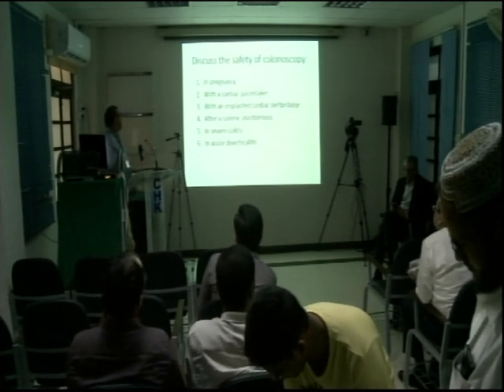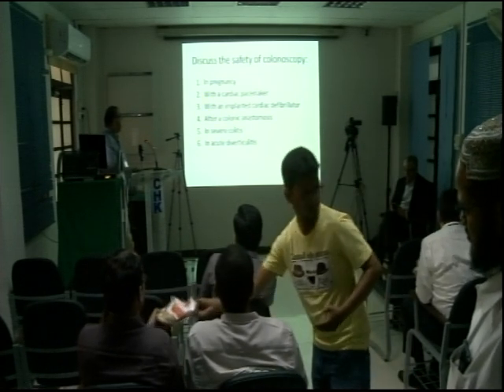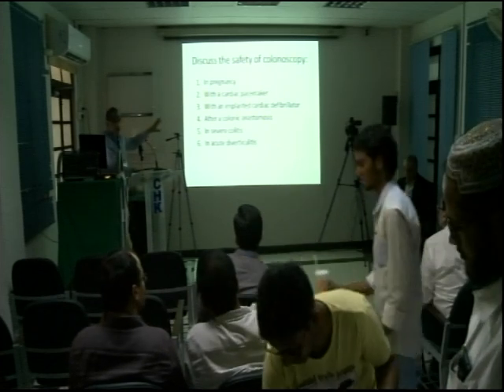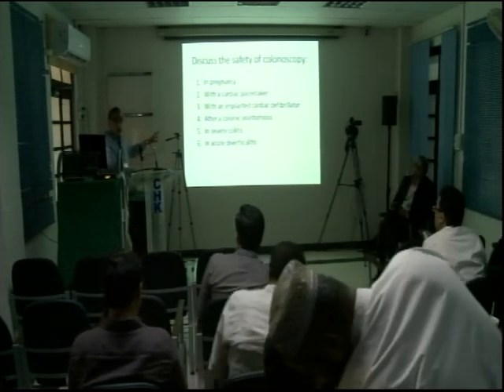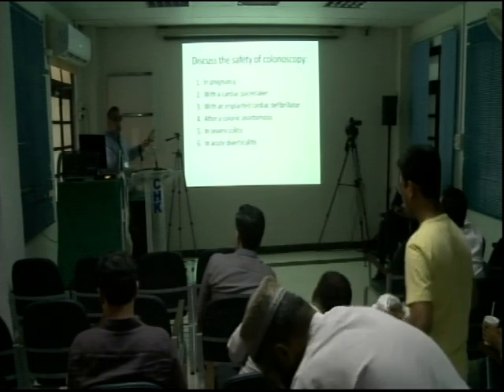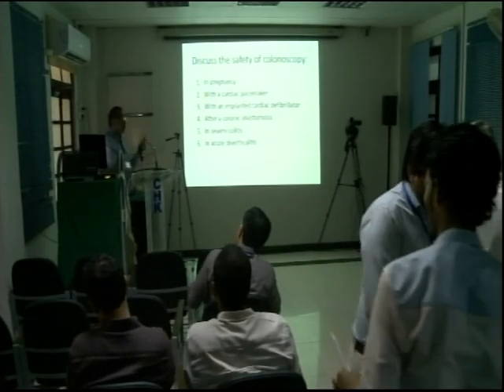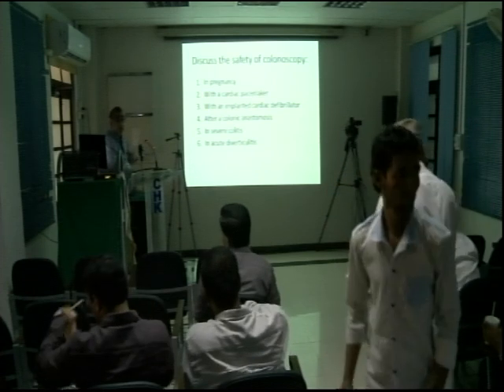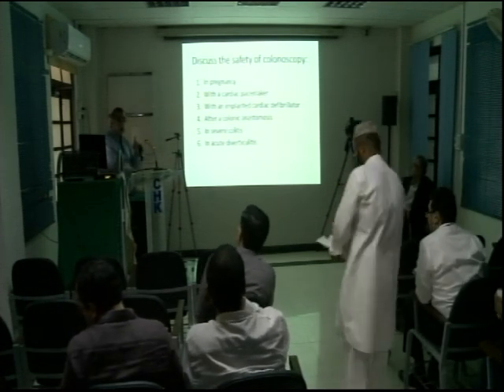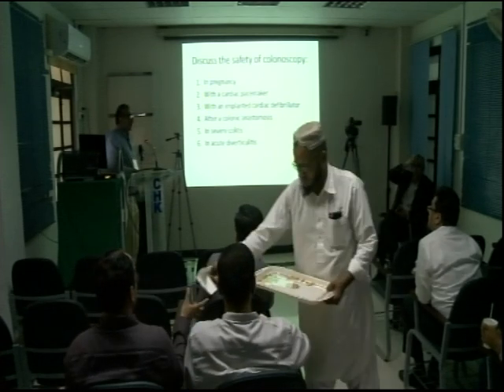Play safe. Discuss the safety of colonoscopy in pregnancy, and in a patient with a cardiac pacemaker with an implanted cardiac defibrillator. These issues come up in your clinical scenarios. With a cardiac pacemaker there is always the problem of diathermy. If it is a normal cardiac pacemaker, you carry on, short bursts of diathermy current do nothing. If it has an implantable defibrillator, then you ask your cardiac technicians to put a magnet on the cardiac device. You inactivate the defibrillator, otherwise as soon as you press the current, it will get a shock.